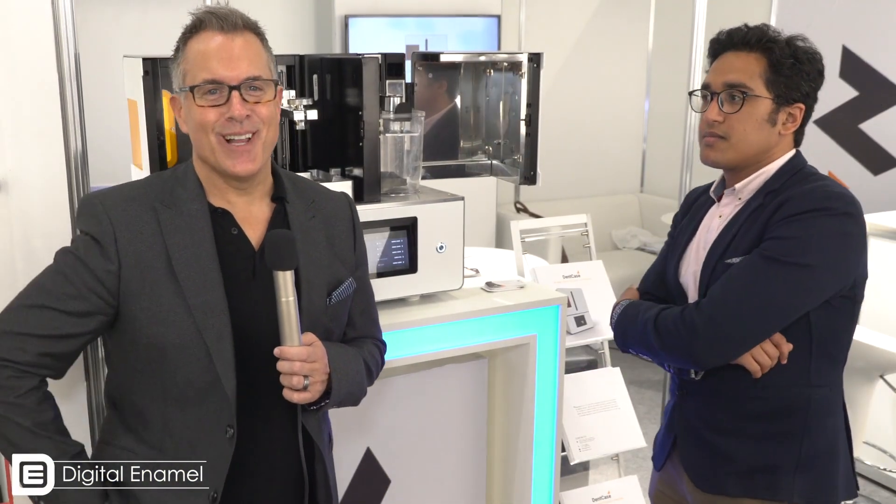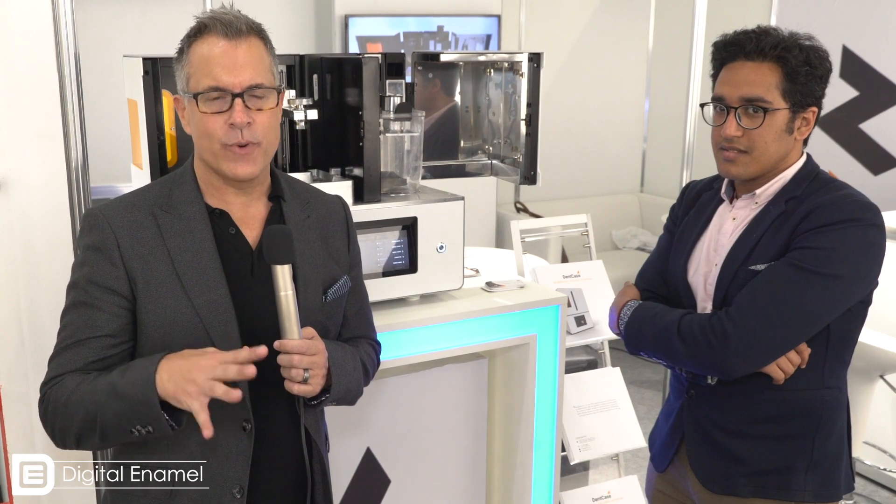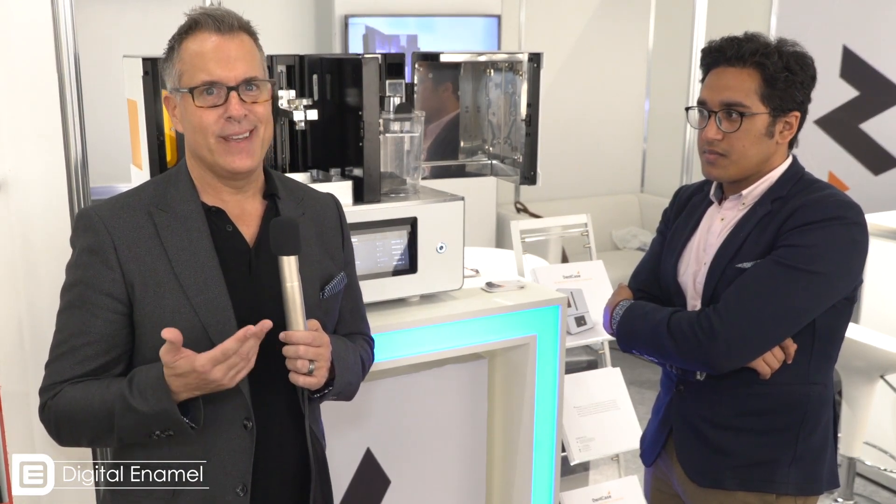Hello everyone, this is Dr. August de Oliveira with Digital Enamel at the IDS. Now, Todd and I came here two years ago, and the big thing was the introduction of dental 3D printing. And as we've done a lot of resin-based 3D printing, what we've found is it's really pretty yucky.